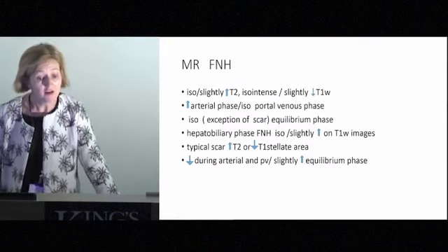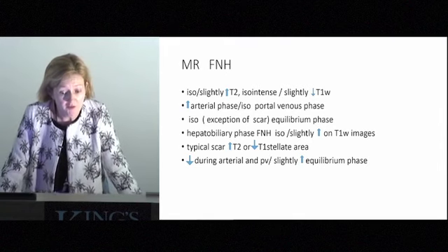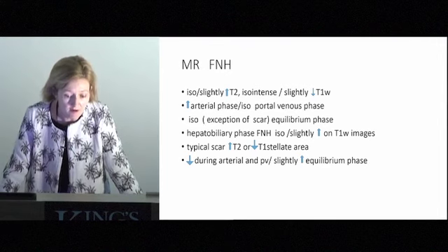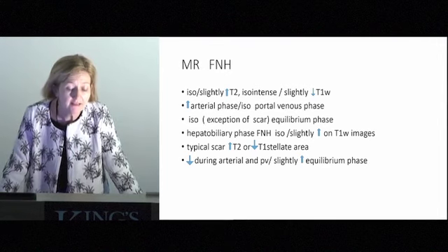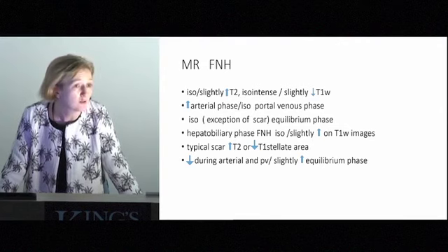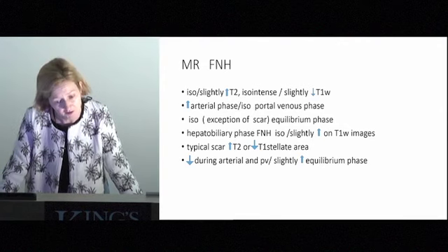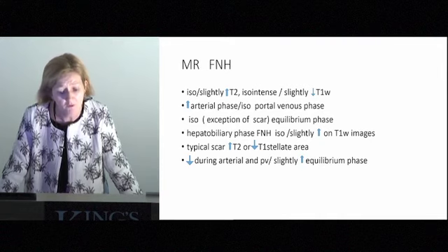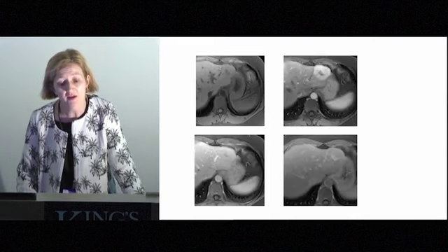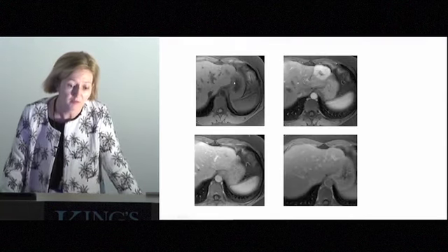On MRI, FNH will have imaging characteristics that are only for it. It will show that it has the scar. With MRI, you may get delayed enhancement of the scar, whereas with contrast ultrasound, the scar doesn't enhance at all because it's a truly intravascular contrast agent. And it will hold on to contrast, and it will hold on to our hepatocyte-specific contrast as well. So they will have their scan and then go on to have probably an MRI.